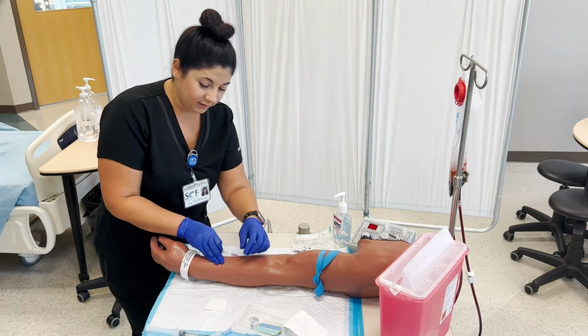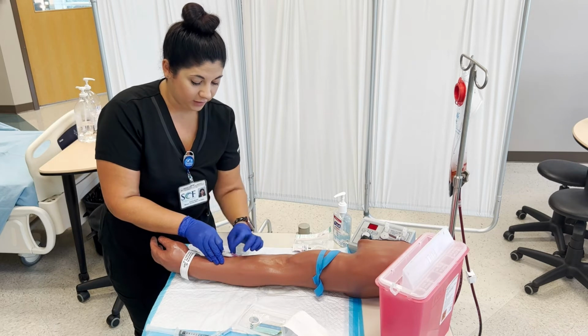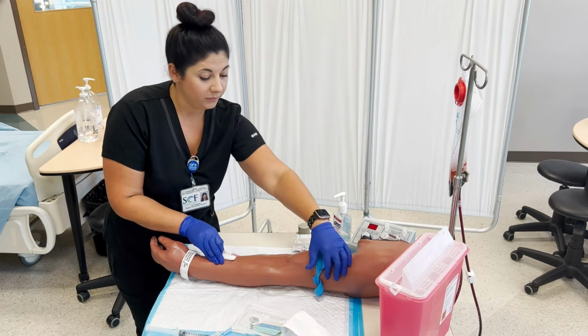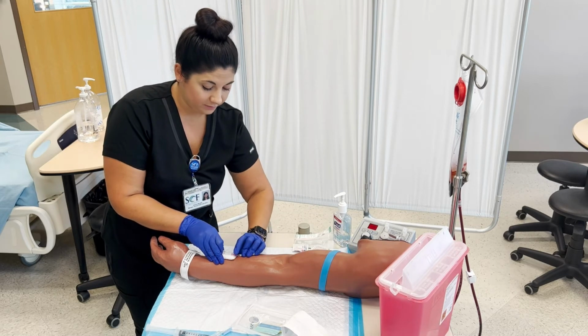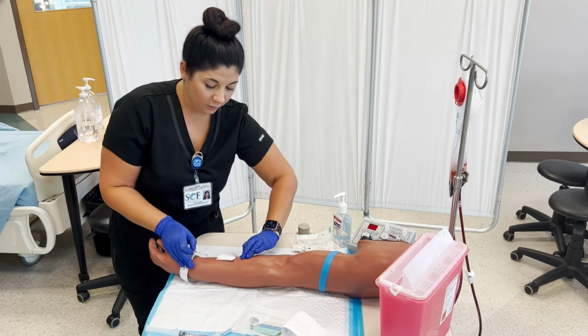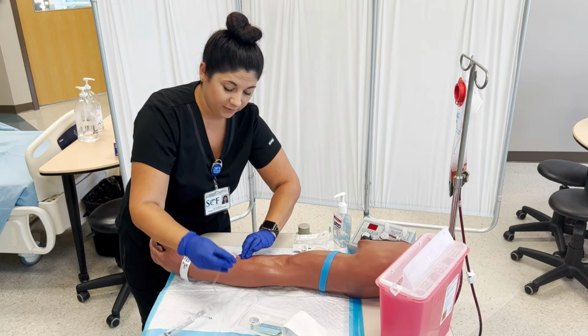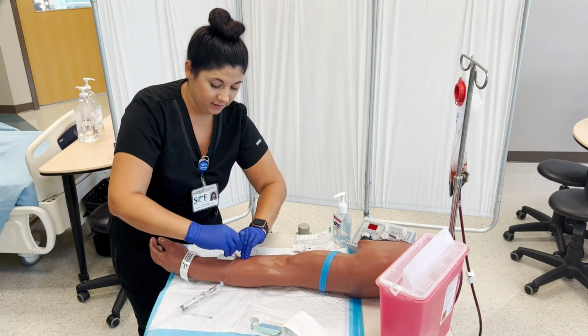Before I pull this needle out all the way, I put a little bit of gauze under here so that I don't have any leaking, and then remove the tourniquet. And you want to hold down so that your patient doesn't bleed all over the place. Go ahead and connect your flush.